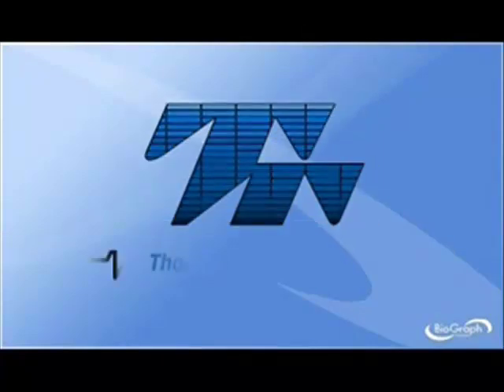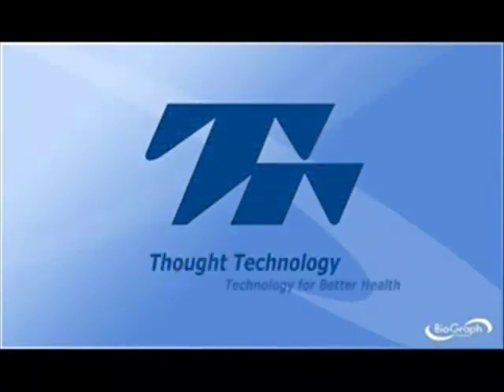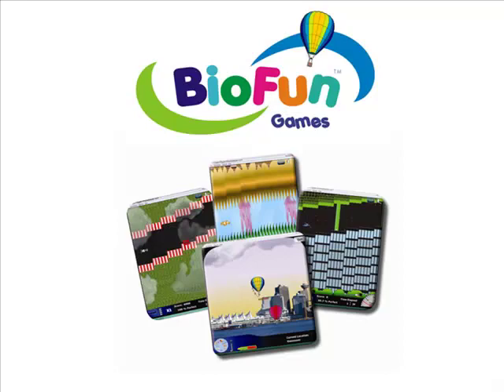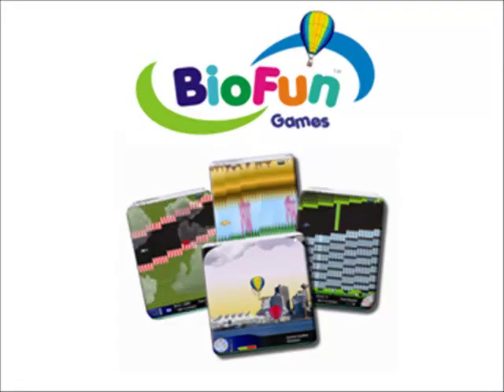Welcome to our presentation of BioFun. BioFun is a software add-on for Biograph Infinity, consisting in a series of video games for biofeedback.